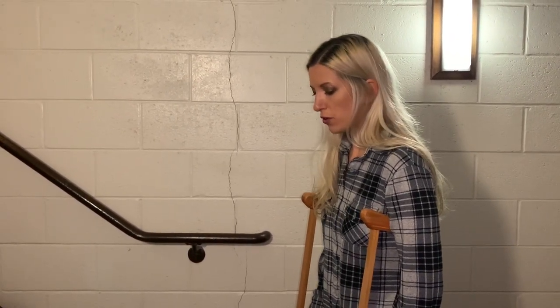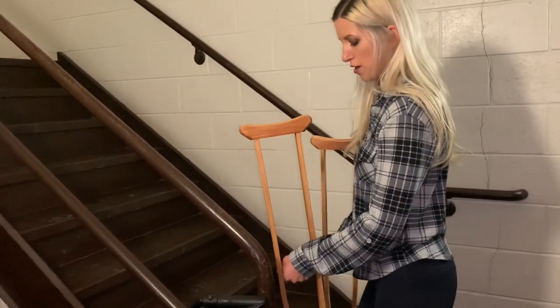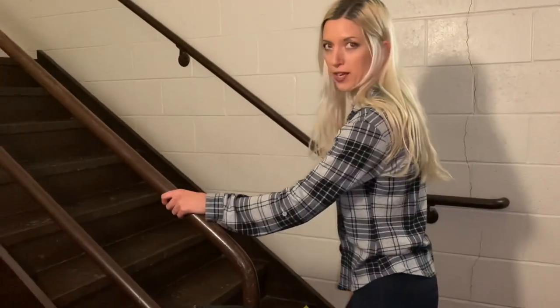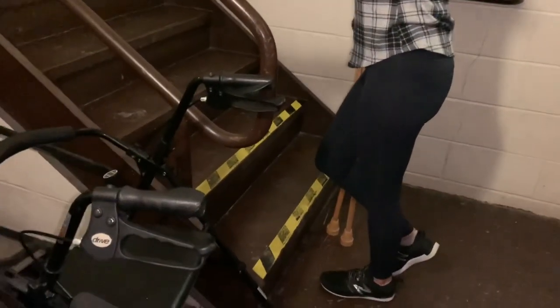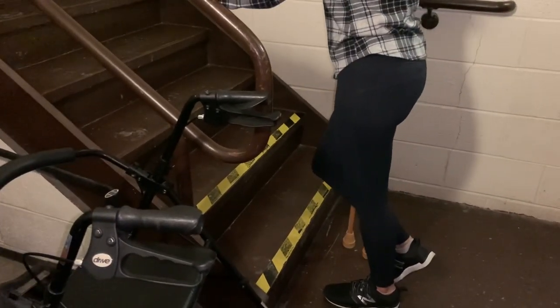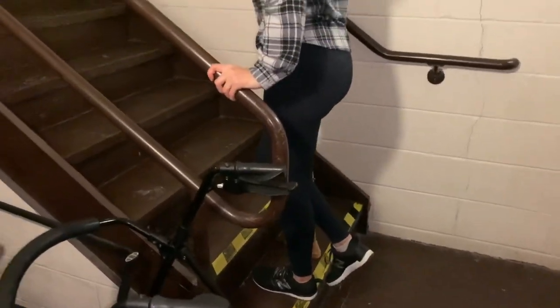So you're going to approach the stairs, and you're going to bring the crutch from the good side over to the injured side. Put them under your arms, grab the handrail, and up with the good. So supporting your weight in your affected side and on the handrail, you're going to push yourself up the stair. And you're going to do one stair at a time.